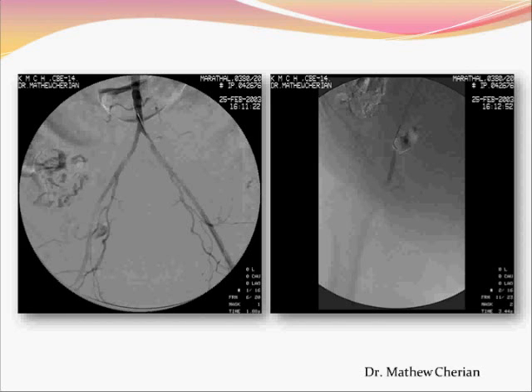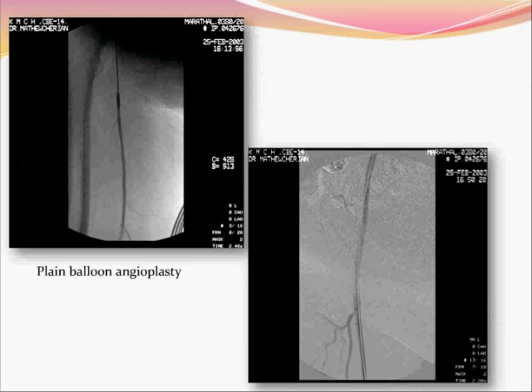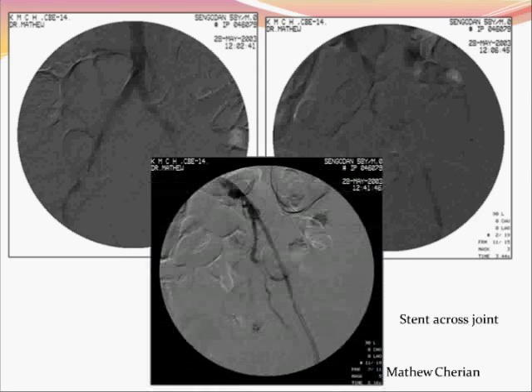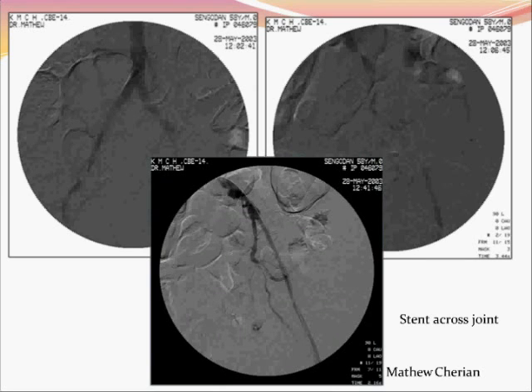Here is an example of an external iliac occlusion, just at the point where it becomes the common femoral artery, and the end result of plain balloon angioplasty — which is the best way to treat a lesion across a joint. Another example of a chronic occlusion of the external iliac artery imaged with CO2 angiography, and the end result after placement of a wall stent across the occluded segment.